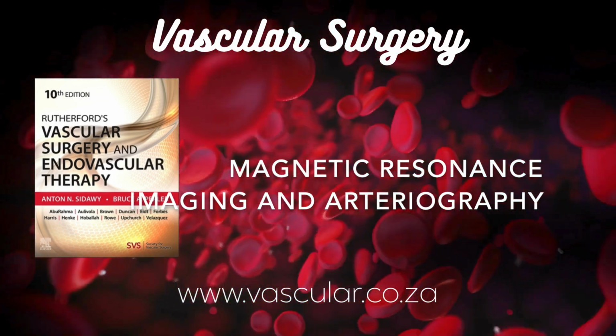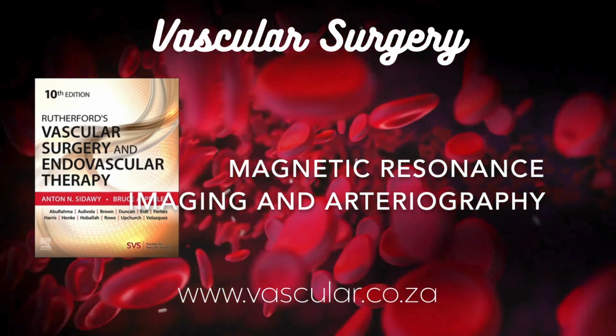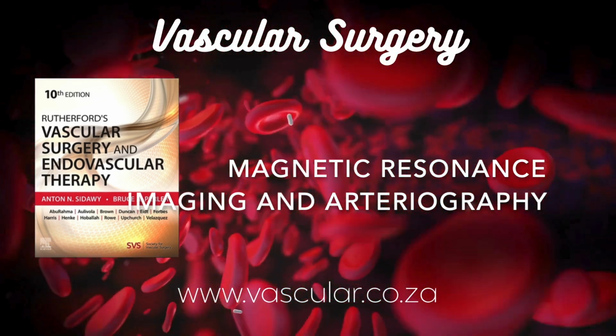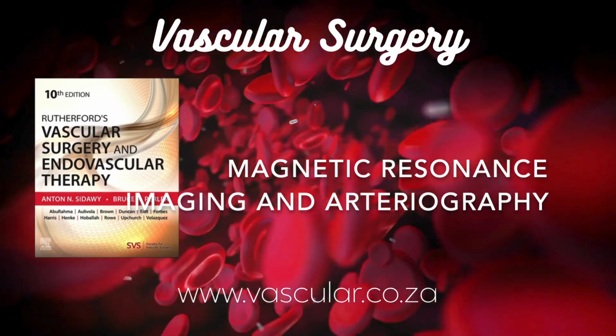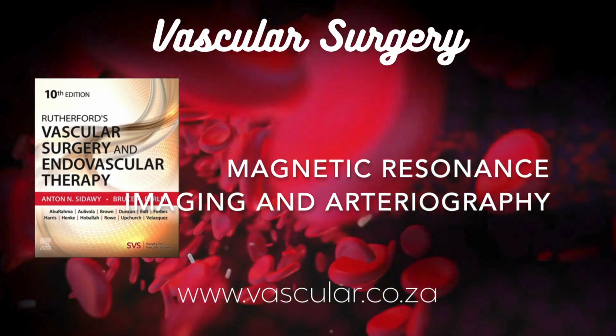Precisely. And there's a trade-off with these different strengths. For instance, 3T systems generally have the potential to give you higher resolution images, maybe faster scan times too, which is often a plus. But the flip side is they also tend to deposit more RF energy into the patient's body. It's something we have to manage carefully.